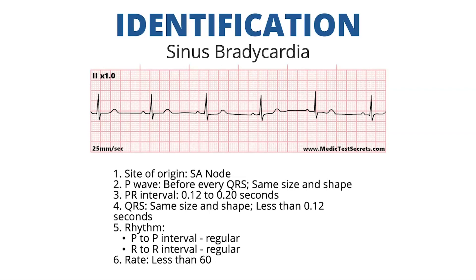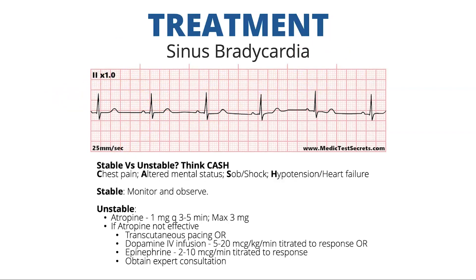Everything else about the rhythm will be normal. As you can see here, all our P waves are going to be the same — upright and looking the same. Our PR interval is going to be normal. Our QRS is going to be narrow, and it's just our rate that is going to be slow, less than 60.